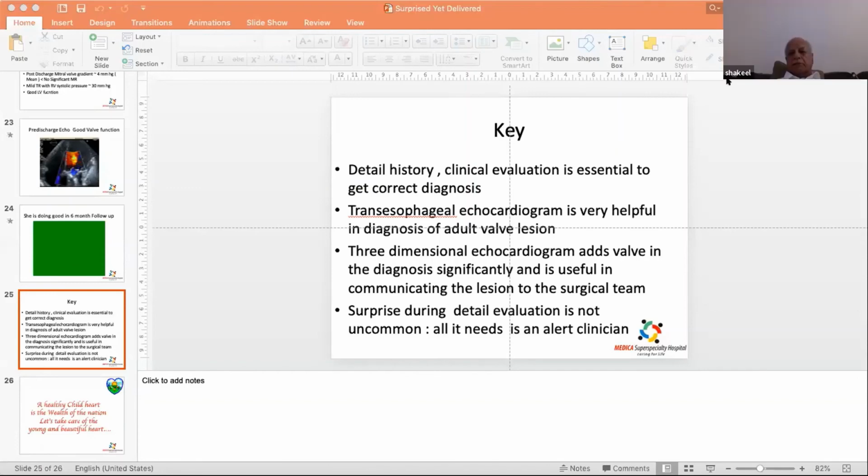Yeah, I think I agree with that. The aortic rim is really something we don't worry about at all. And the IVC rim, if it's absent, that should be considered a contraindication.